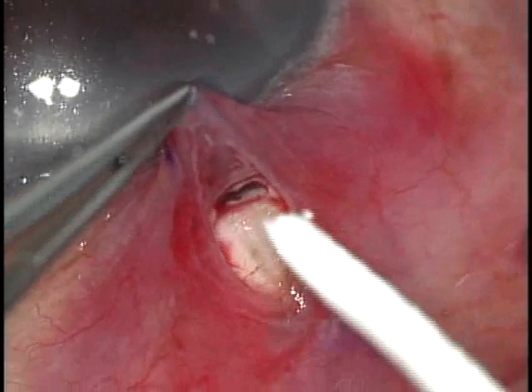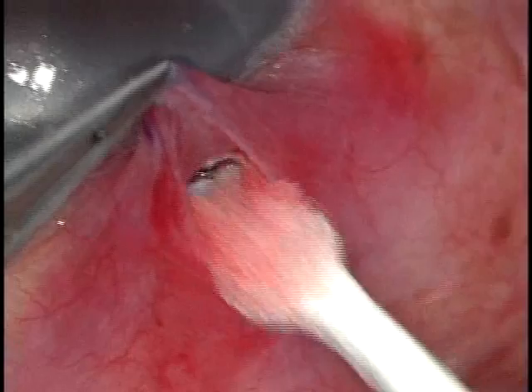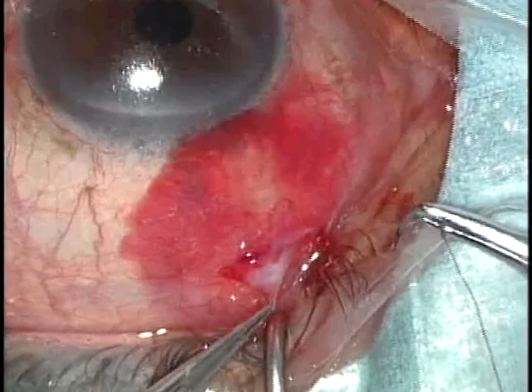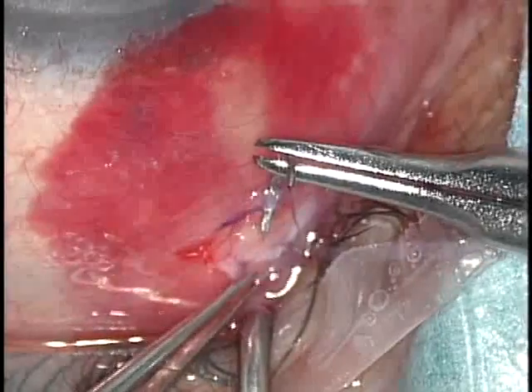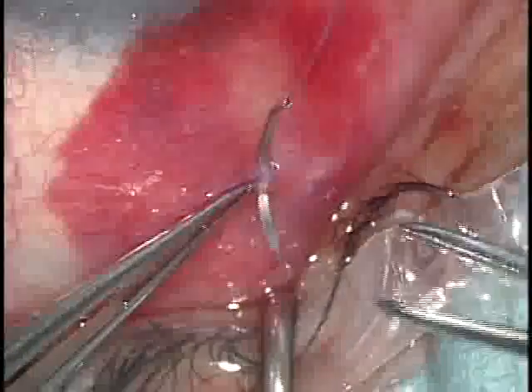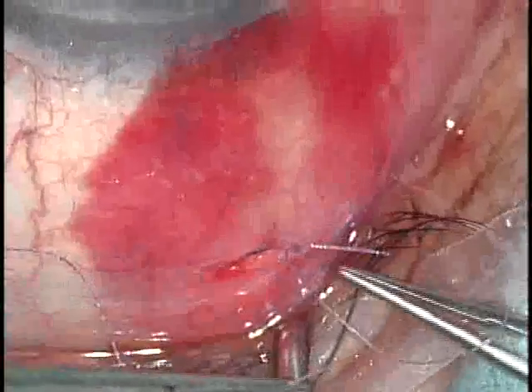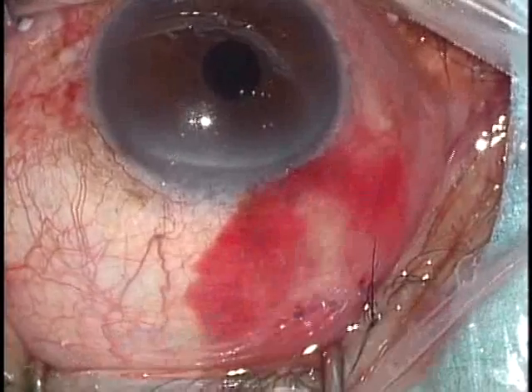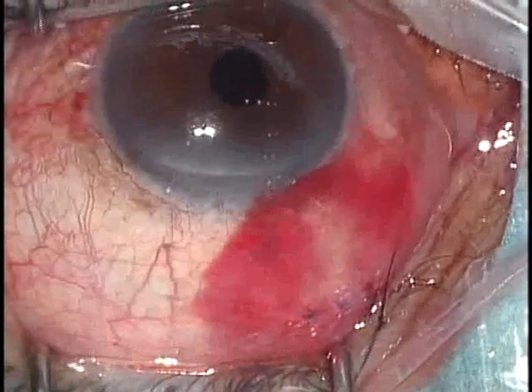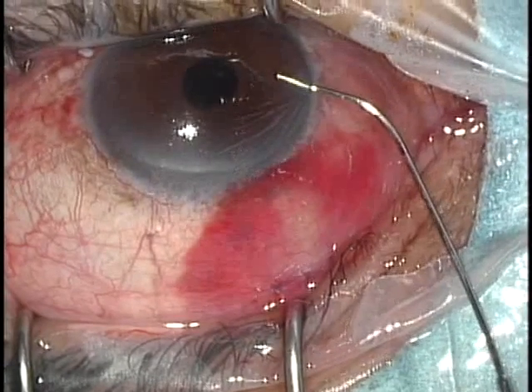Adequacy of filtration at the edge of the tunnel is judged with cellulose sponges. If leakage seems inadequate, the surgeon may add another square of bites with the Fukasaku Micro Punch. Finally, I close the peritomy. Because of the small incision size, a minimal number of sutures is sufficient. Balanced salt solution is then injected into the anterior chamber through the paracentesis with a blunt cannula to elevate the filtration bleb.